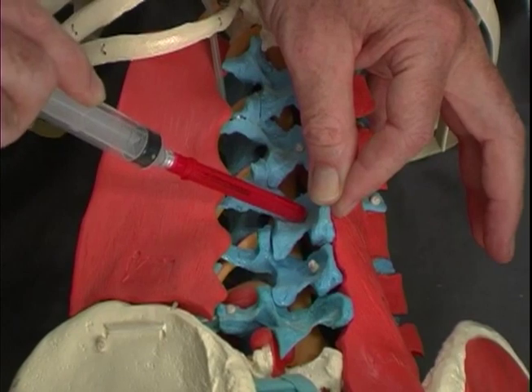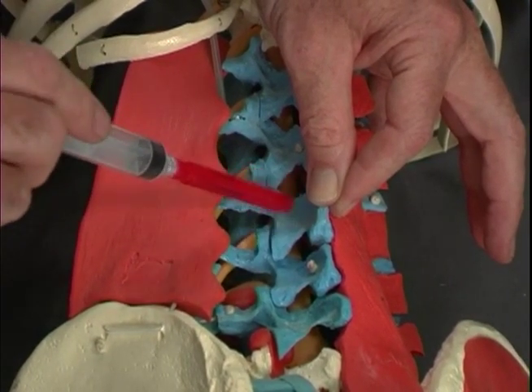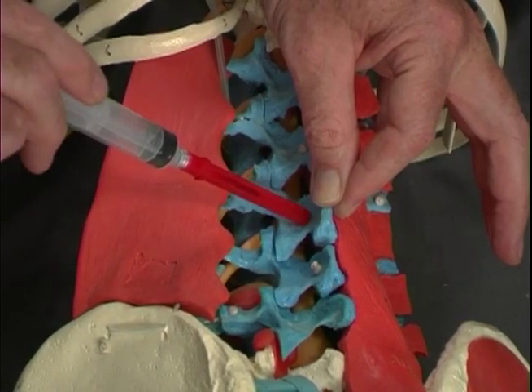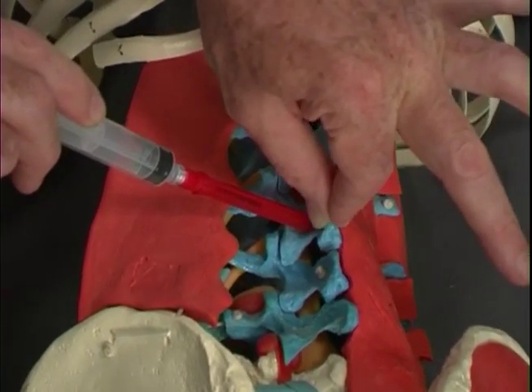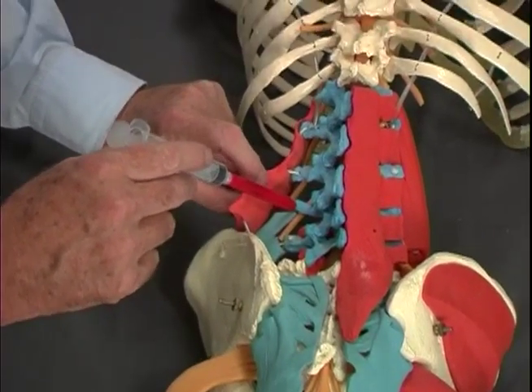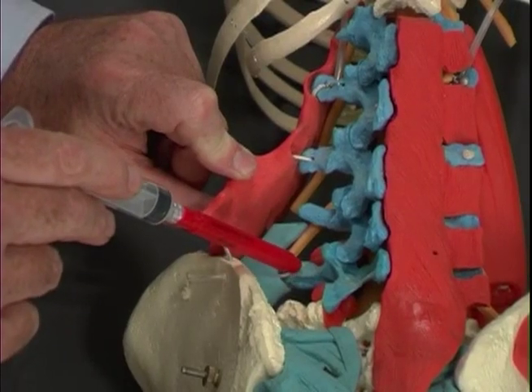We need to be careful in doing this not to direct our needle caudally or cranially so that we might do an inadvertent spinal tap. But it's a very safe injection if we're careful to go directly in underneath our finger that's attached to the spine. In addition, we wish to inject the tips of the transverse processes at L4 and L5.